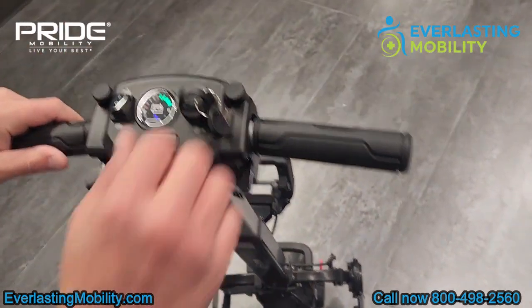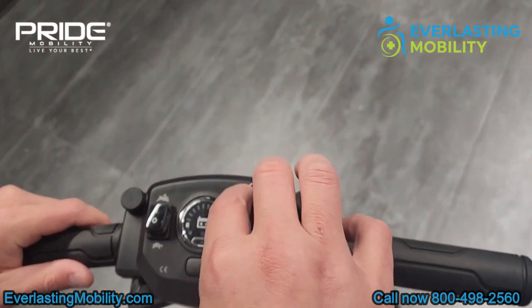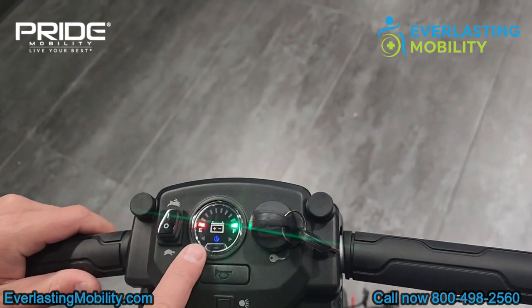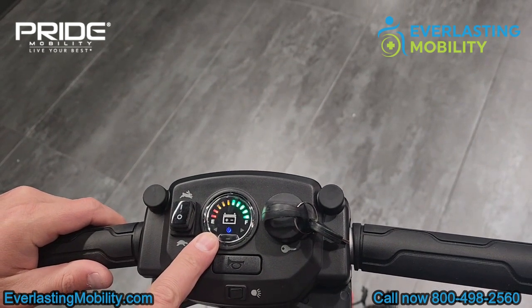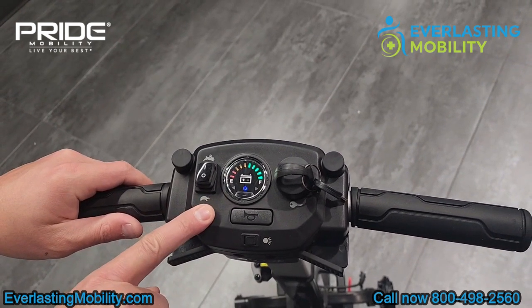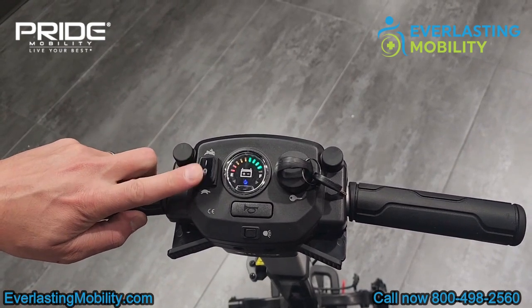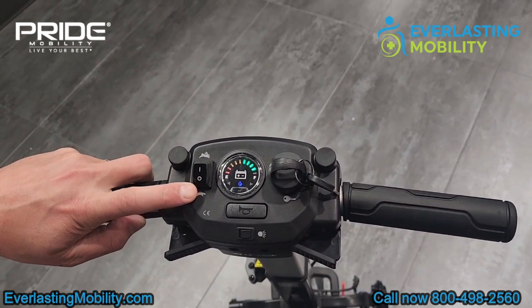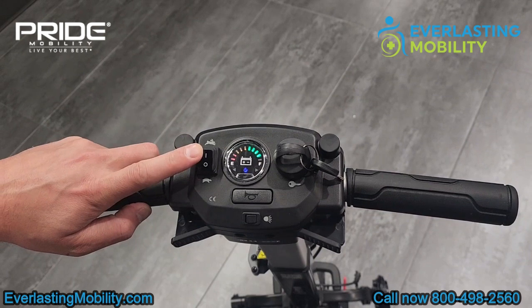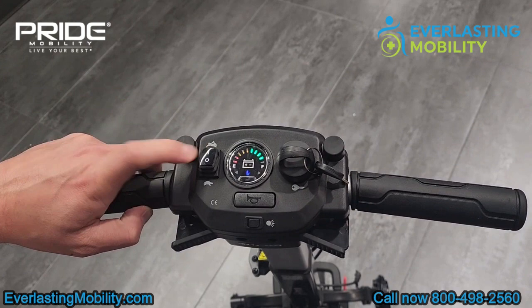Now onto the tiller. The Aigo comes with two keys, and this is your battery gauge — right now it's almost fully charged. If you get in the habit of recharging when it gets to about halfway and do that consistently, especially when you first get it, it will help increase the longevity of the battery. This is a two-button switch for speed control. When pressed down towards the tortoise, your top speed is cut in half — around two to two and a half miles per hour. Flip it up towards the rabbit and you'll reach the top speed of around four miles per hour.